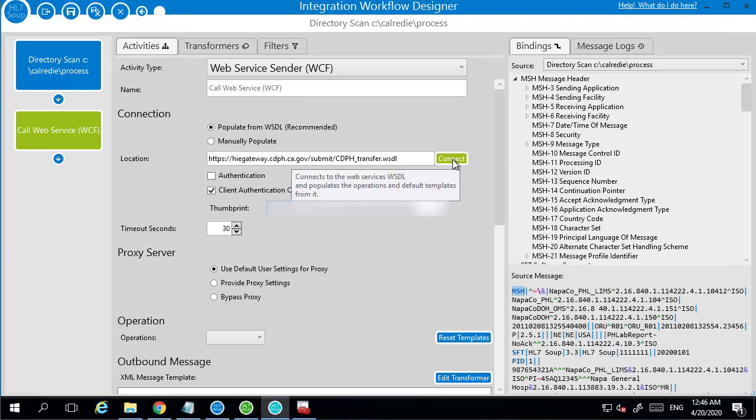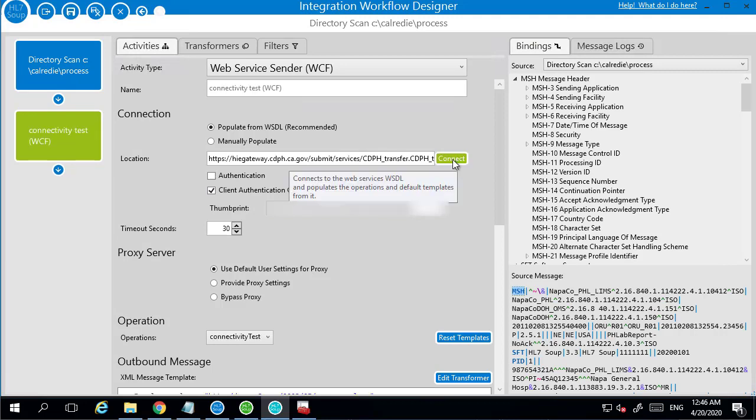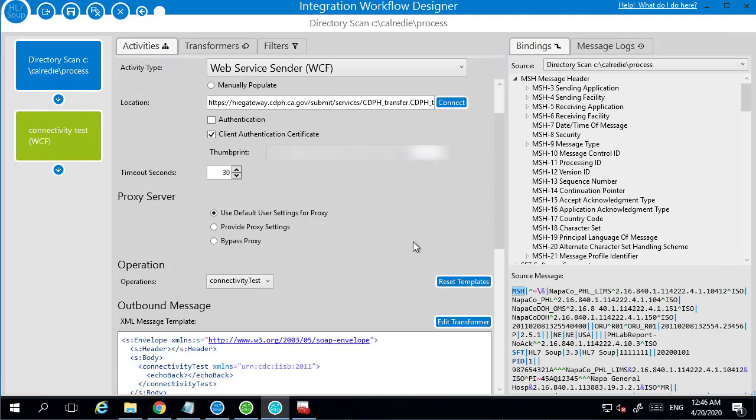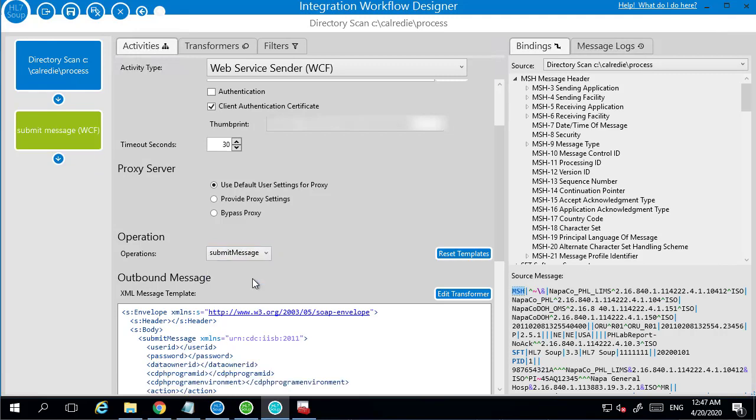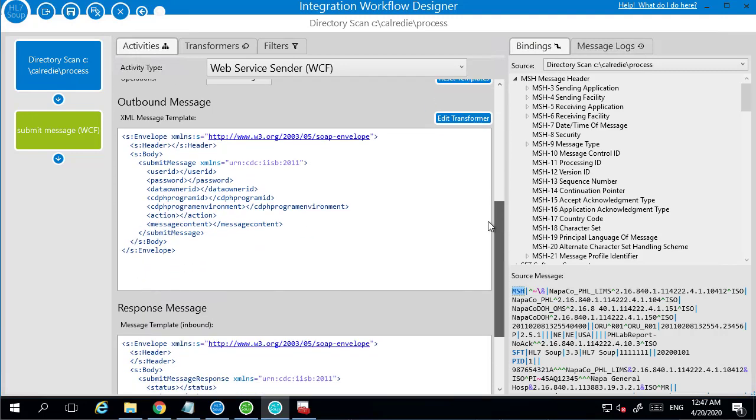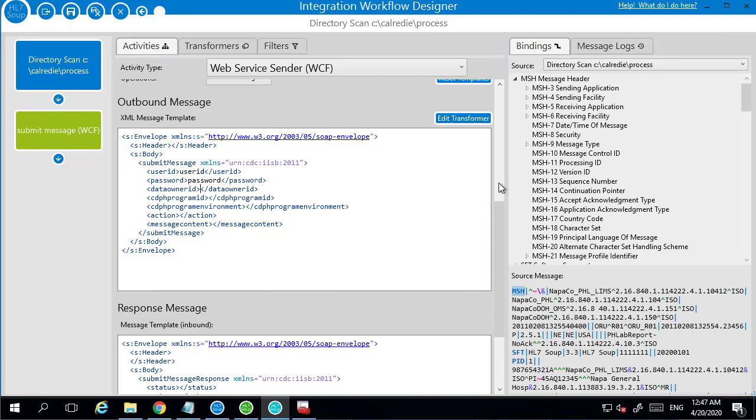So now I can hit Connect. And it has gone to CalReady and successfully connected to that data. It's brought back the list of operations that are now available to me. So I can, there's a connectivity test, and there's a submit message. So I'm going to choose Submit Message. And I'm going to scroll down and see, it's pre-populated all the fields that need filling out for me. So you do need to pass in a user ID. So I'll put a dummy user ID, a dummy password. The data owner ID, if you're sending it on behalf of someone, you can use their user ID. But I'm sending it on behalf of myself, so it's just the same as my user ID.